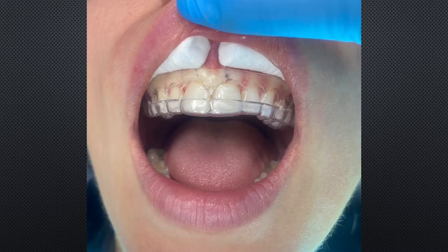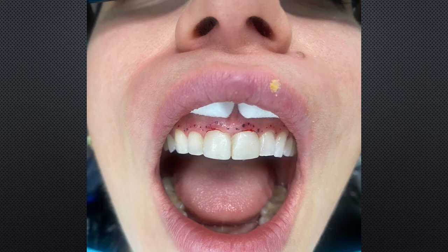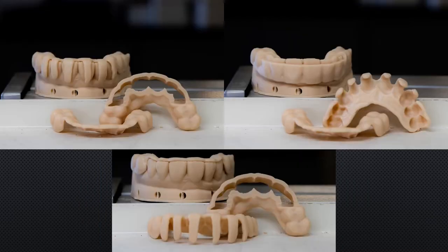So she puts it in, the patient had some reaction to the freezing, so the tissues are really blanched, but she pushed them up there and just marked it with a marker, and then she freehanded the rest with a laser.